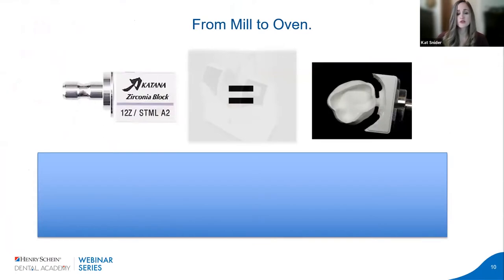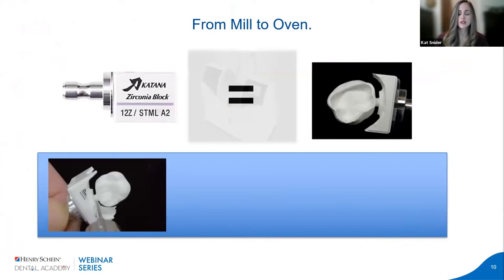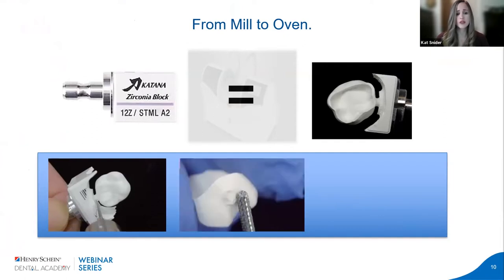Now that you have your block and you've milled it, it is going to come out of the mill. It's still attached to the sprue and the ingot. You will need to make sure you're using gloves to minimize any cross-contamination with your oils or lotion on your hands. We're going to remove the block with a lab hand piece using approximately 5,000 RPM and some light pressure. This comes out of the mill in a very chalky, soft state, a little harder than chalk, which we refer to as the green state.